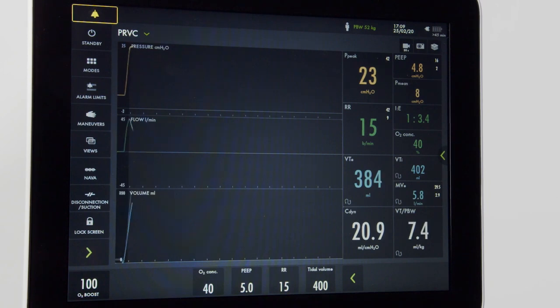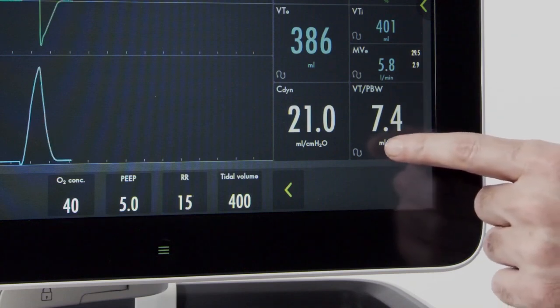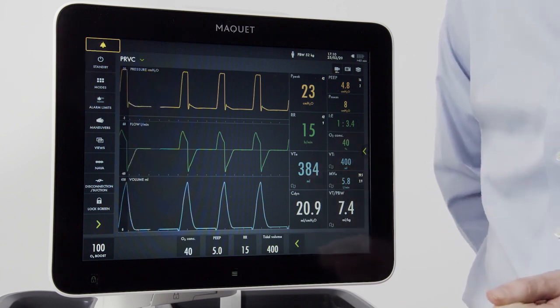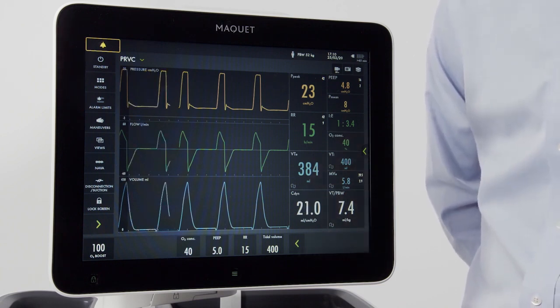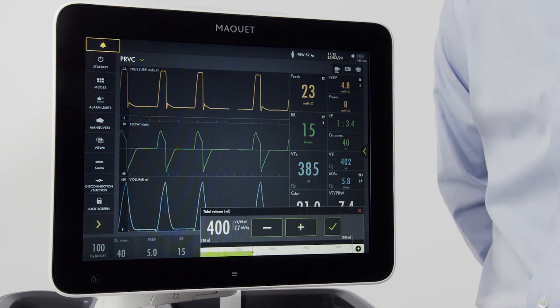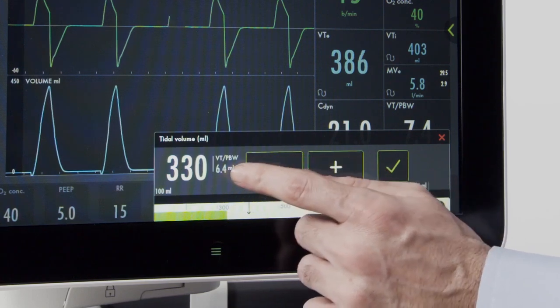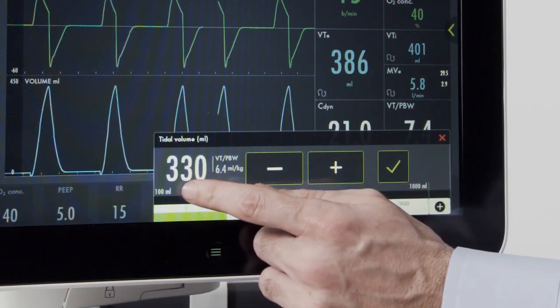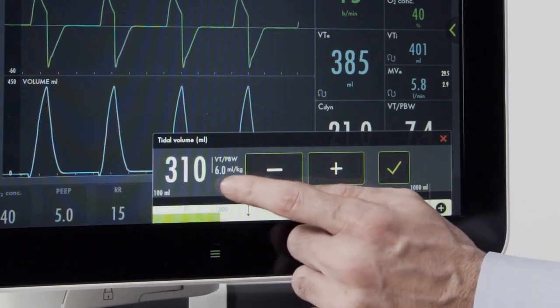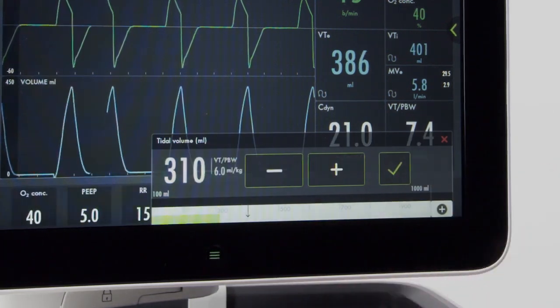Once I've pressed done, I now have the predicted body weight displayed on the screen, and the tidal volume for each breath is now displayed. If I want to adjust the tidal volume according to body weight, I can do that on the screen. When I push my tidal volume, if I want to ventilate six milliliters per kilogram for this patient, I can adjust that directly on the screen. I now have the tidal volume, total tidal volume, as well as the tidal volume per body weight displayed. Dropping that to six, the proper tidal volume for this patient is 310 to deliver six per kilogram.